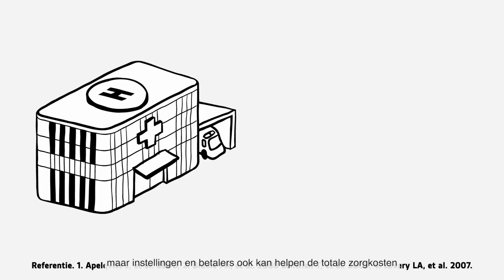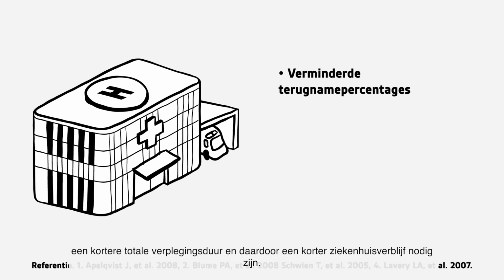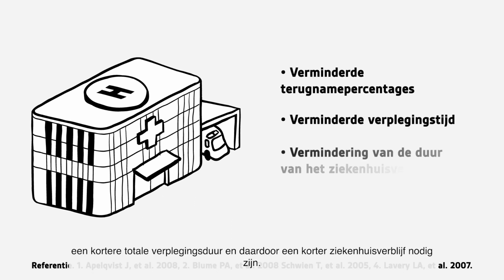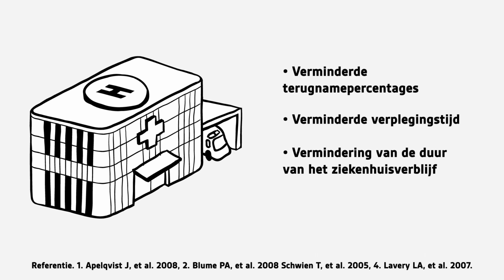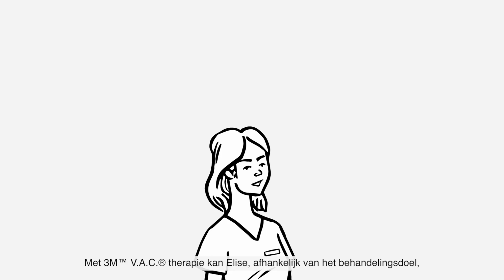Studies have demonstrated that VAC therapy not only helps improve patient outcomes, it has the potential to help facilities and payers lower their overall cost of care by reducing readmission rates, total nursing time, and associated length of hospital stay. VAC therapy offers Elise many different wound care options depending on the goal of therapy.